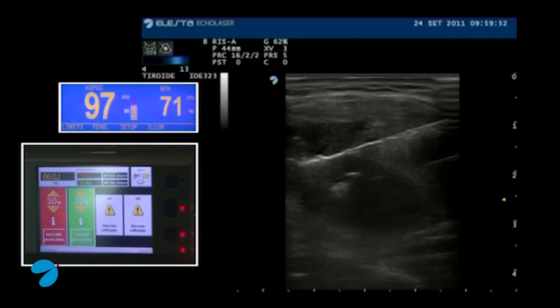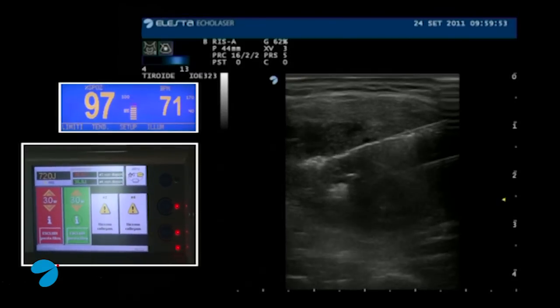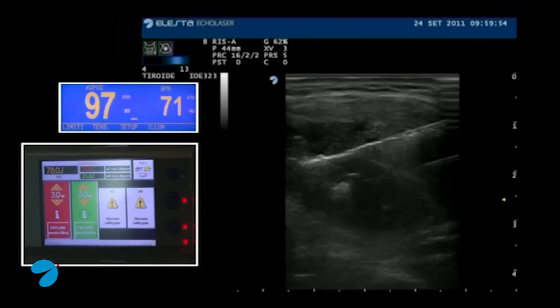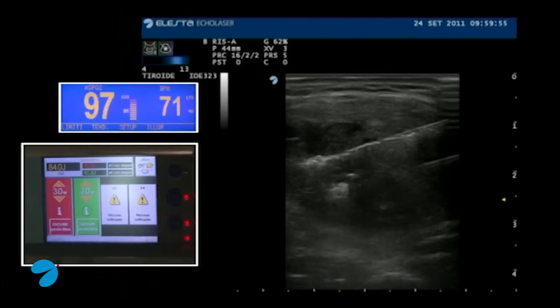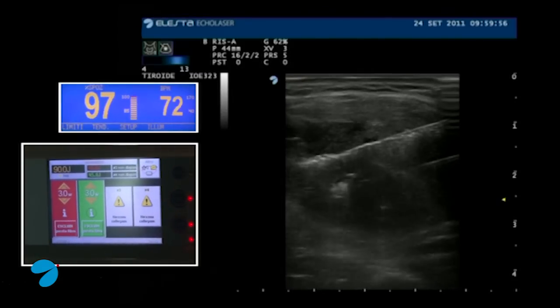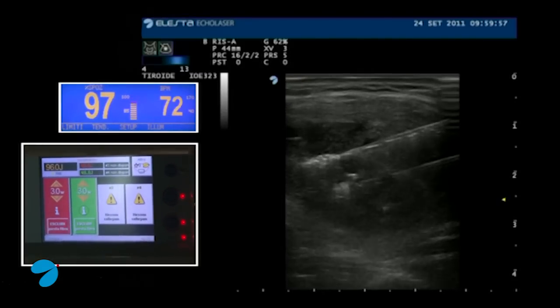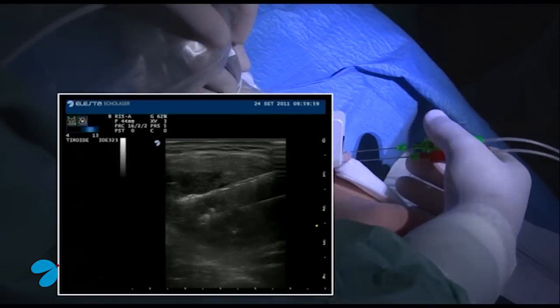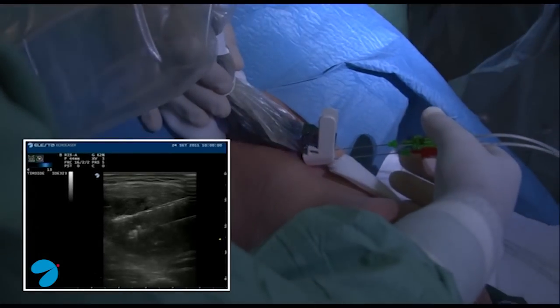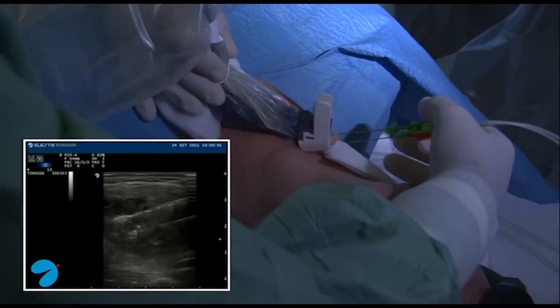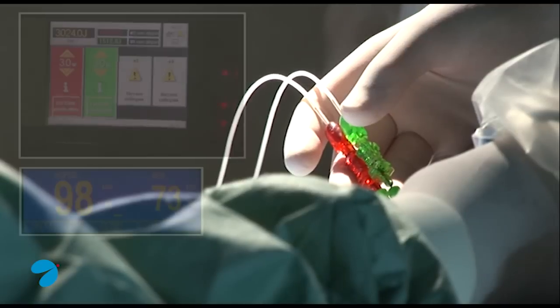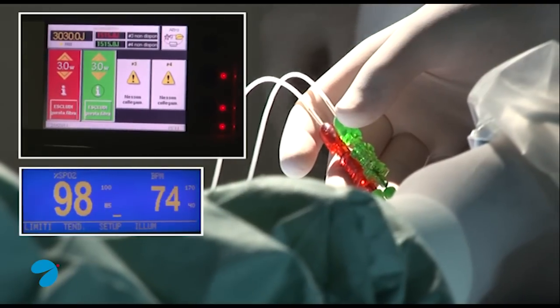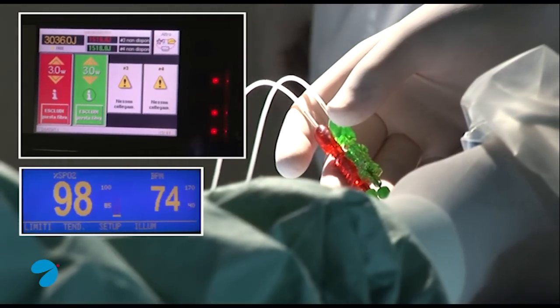Fibres are delivering energy into the nodule. We check vital parameters such as cardiac frequency and oxygen saturation. We check the energy delivered for each fibre.